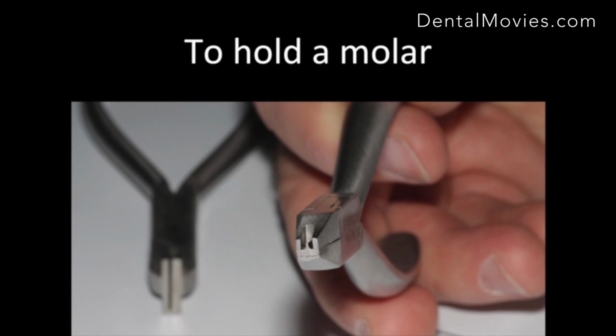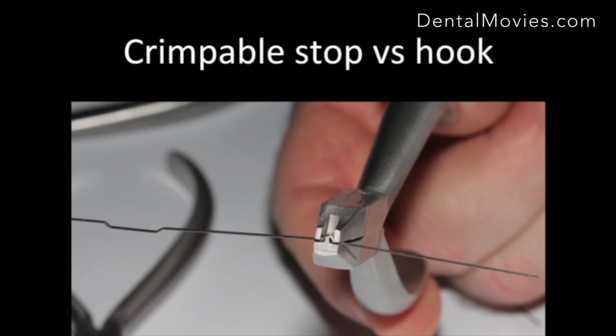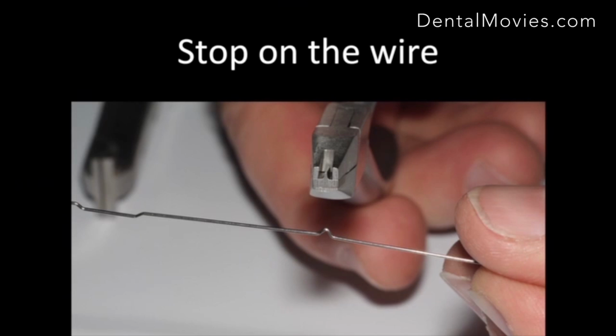This is, if you don't want to use a Jaraback, like in your case, right? If you don't want to use the Jaraback, you can just get this plier, press it, and bingo, you get a stop in the wire. You understand? But that's ultimate in laziness, really. Get your Jaraback and do it, but up to you, right?